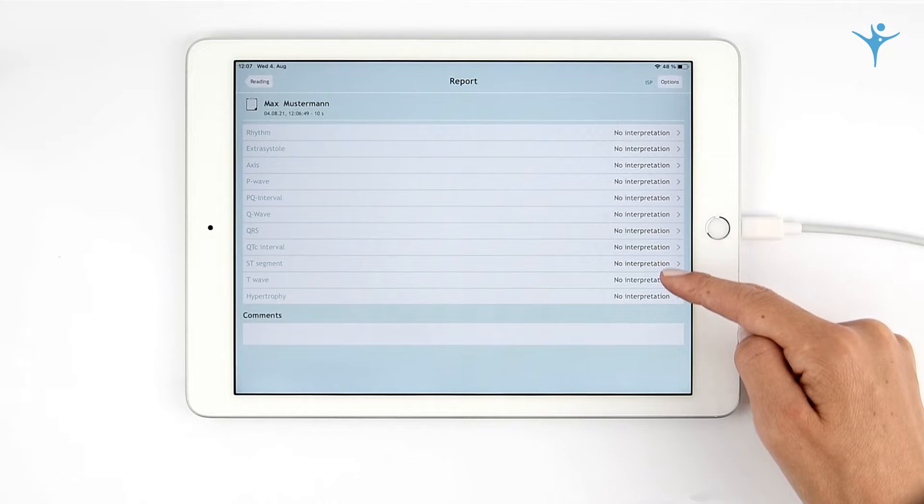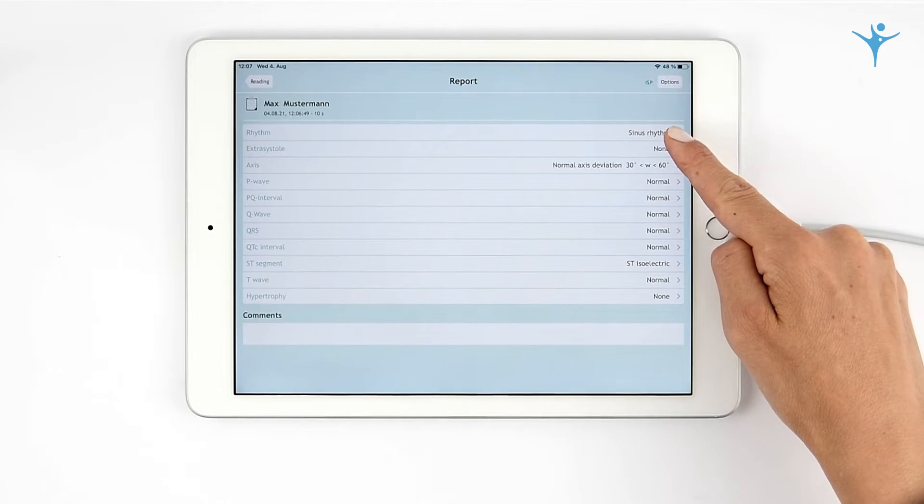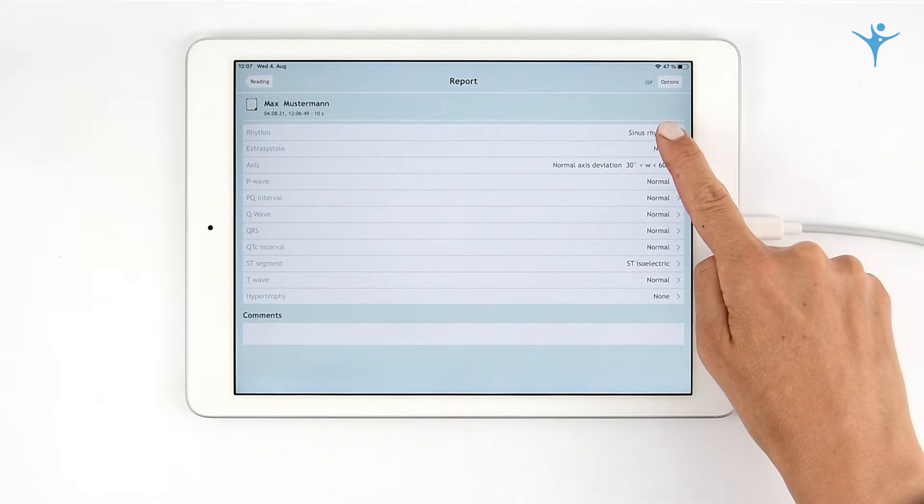In the case of a normal ECG, the values can be added easily to the report. In the case of a pathological ECG, you can set the appropriate parameters.